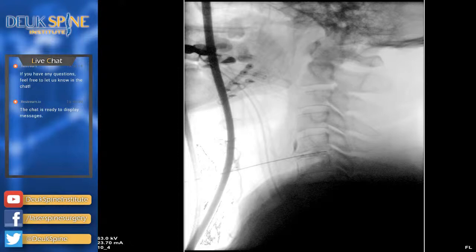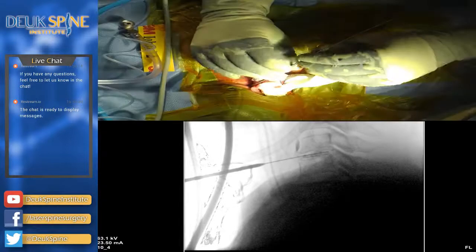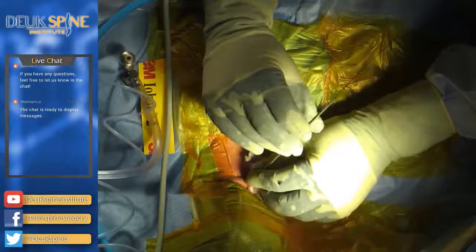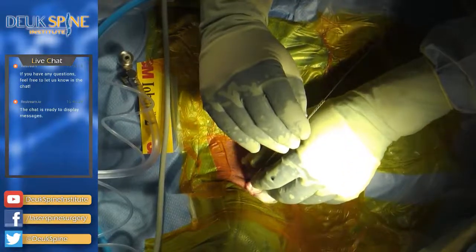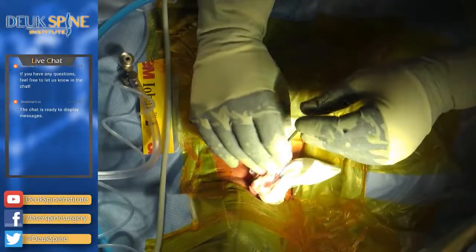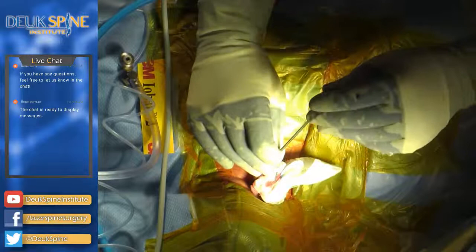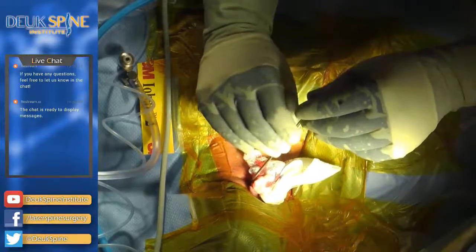There's no way to avoid that. All right, as we go down with our dilator, I want to make sure the guide wire is not advancing. I want to bring my dilator through the tissues between the carotid sheath on the lateral to it and the trachea and esophagus medial to it. Are you pulsing? Yes, sir. Try to reduce the field. I mean, your field is way too wide. Why would you not have brought your collimator in a little bit so you don't radiate my hands?